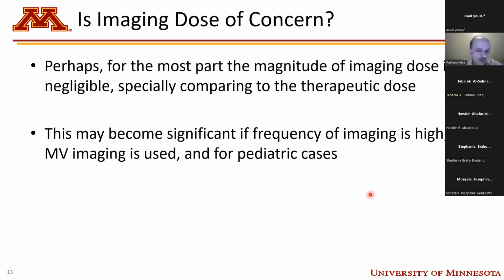But it may become significant if the frequency of imaging is high, if the patient is imaged 2 or 3 times for position adjustment, and so on and so forth. If megavoltage imaging is used, the dose from those has traditionally been higher.